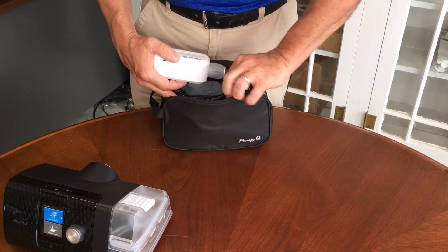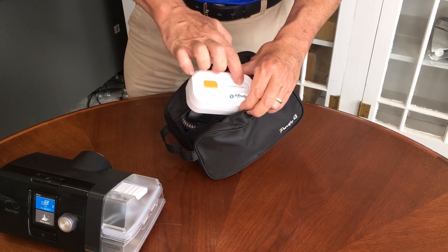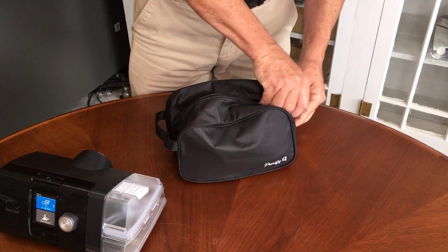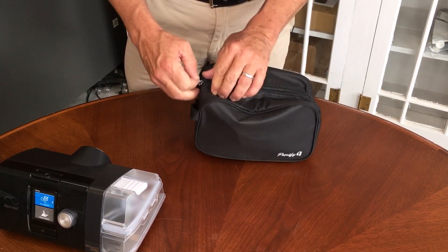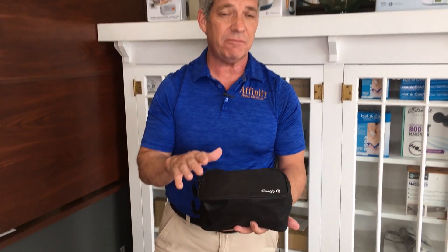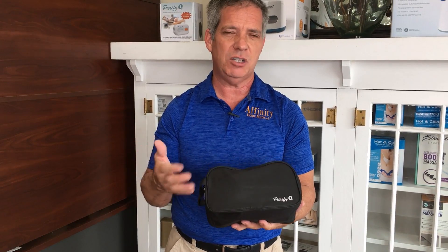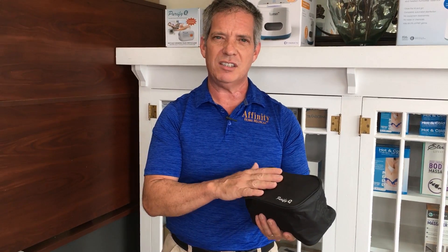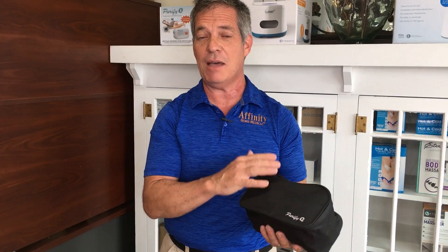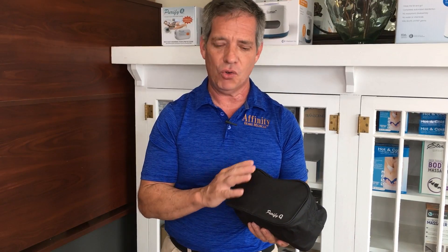Then you're going to just turn it on right here — just hit that button once, it tells you that it's on and running — place it in there and zip it up. Because it does not have any sort of filtering system, if the ozone should escape the bag, it's not filtered in any sort of way, which is a plus and a minus. It's not good to breathe ozone, so I recommend setting this in a room separate from where you are. Let it run — it's going to run for about 30 to 35 minutes — and your CPAP hose and mask will be clean, free of virus, bacteria, mold, all of that.